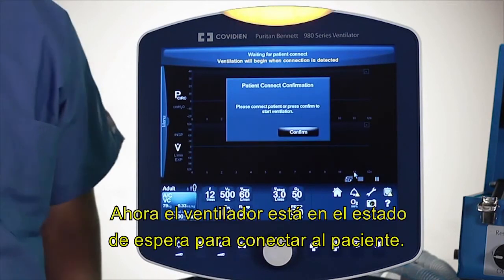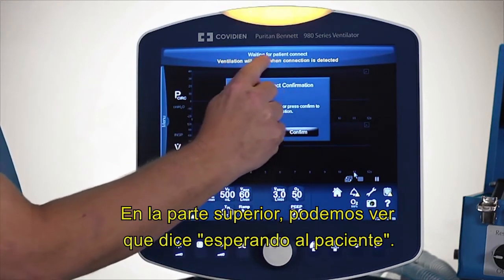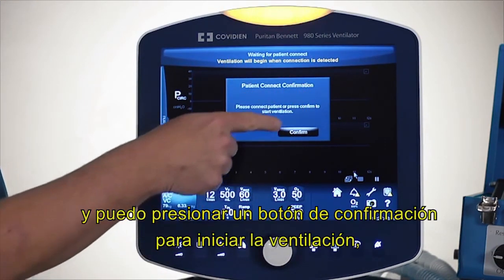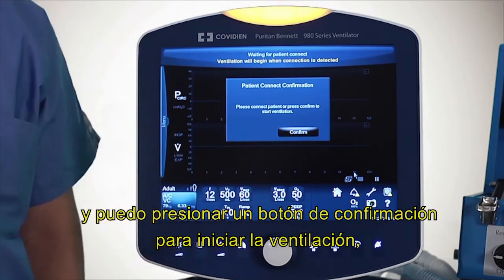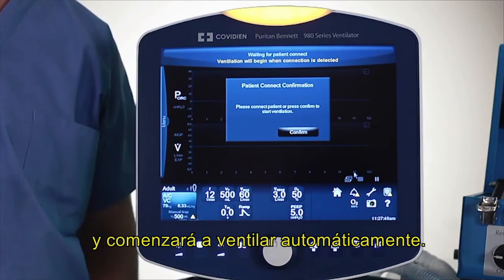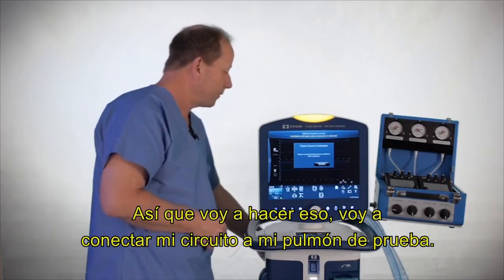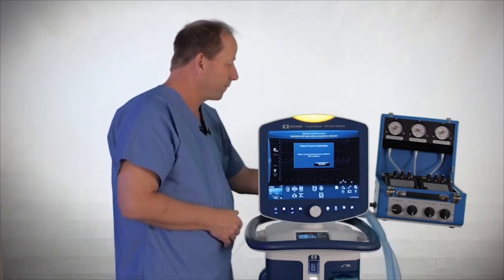Now the ventilator is really in a waiting-to-connect-to-the-patient status. On the top we can see that. It says waiting for patient. And I can push a confirm button to start ventilation, or I can just simply hook up the circuit to connect to the patient and it will start ventilating automatically. So I'm going to go ahead and do that. I'm going to hook up my circuit to my test lung.